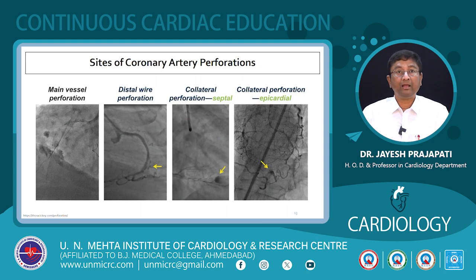Collateral perforation, particularly epicardial collateral and myocardial collaterals. So this is, we have to be important. So epicardial perforation, the risk of tamponade is very high, while the myocardial means septal collateral, when it perforates, can lead to a septal hematoma. Sometimes it can lead to myocardial hematoma, can lead to a dry tamponade. Dry tamponade means there is no collection into the blood, collection into the pericardium or somewhere else, but it is related to hematoma and the cavity compression occurs, and sometimes it can lead to the hypotension.